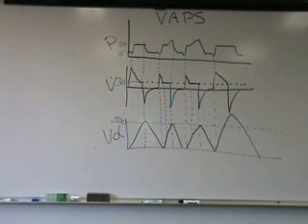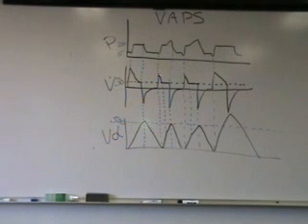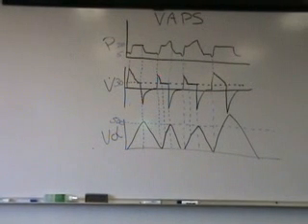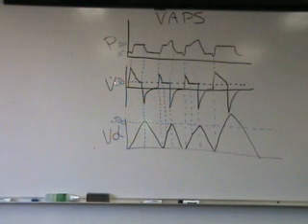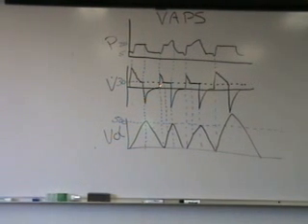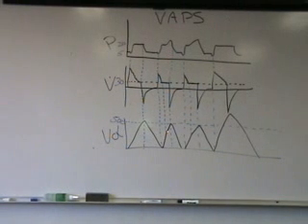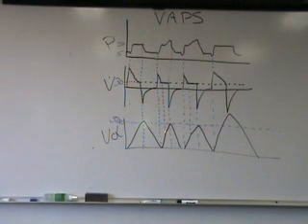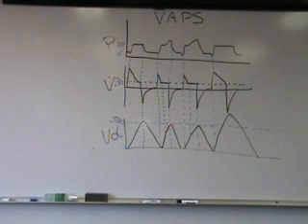So as the patient triggers the breath, they get a high initial flow rate, which decelerates. At the point that the flow rate decelerates to your set flow rate, the ventilator says, has my volume been achieved? In breath 2, the volume hasn't been achieved yet. Therefore, the flow rate will stay at the set flow rate, 30 liters per minute in this case, until the volume is achieved.